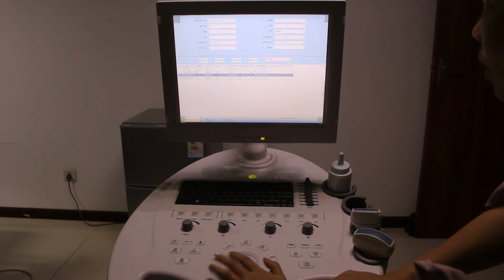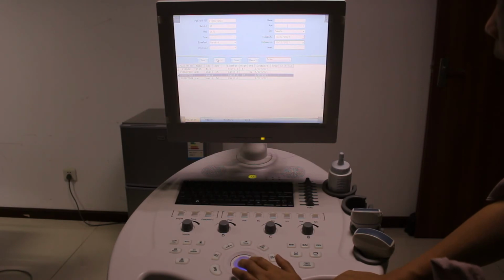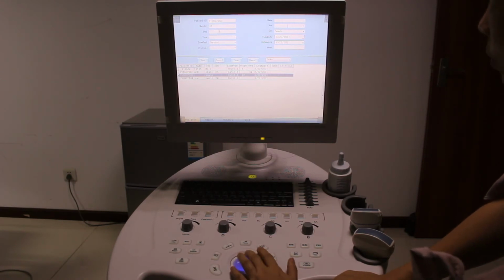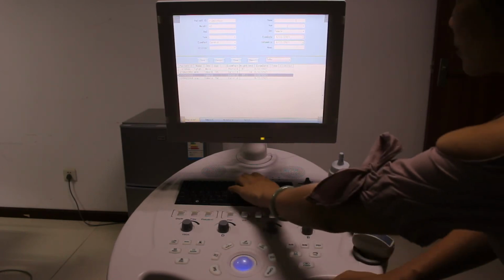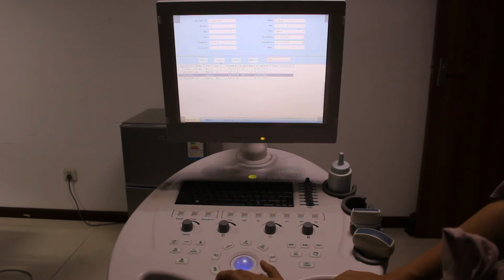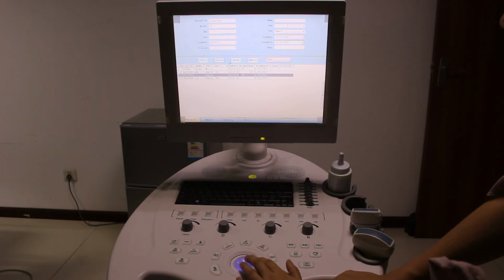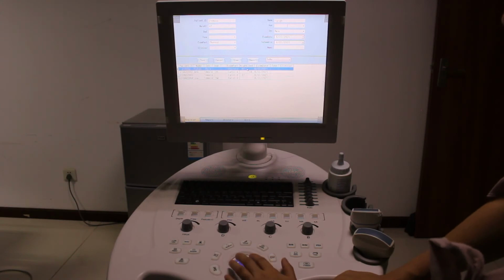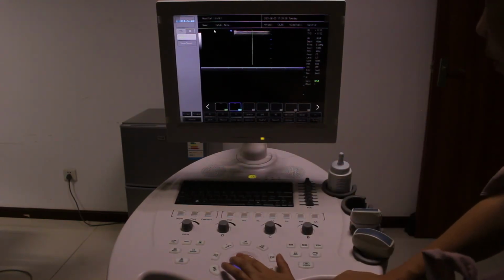Also, when you input the information, let's say on this one, maybe this is wrong, then you can press cancel. So see, this information is removed. Maybe you input it by mistake, you want to cancel it. Then press cancel, the information is removed. So the exam, when you find the related patient, then you press exam, so you go back to the exam. Look, this is the name.